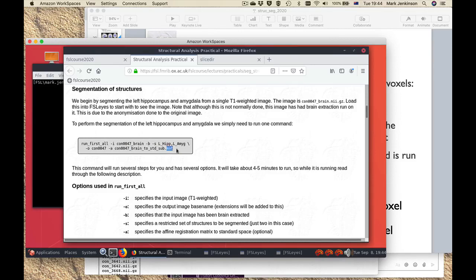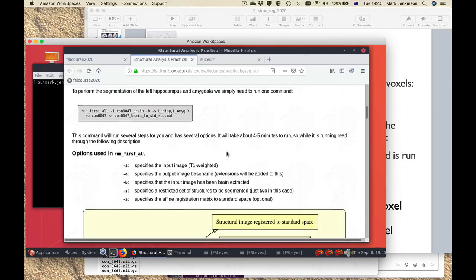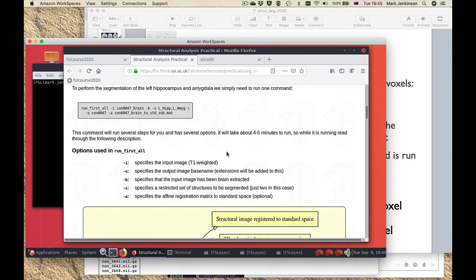In this instance we're actually going to give it the results of a registration — a matrix which you should be familiar with from having done linear registrations before. We're passing that in just to save time; it's one that's already been pre-calculated. In practice you could run this command without that section and it would automatically calculate the registration as part of the command. So that one command does all three sections of the segmentation for you.